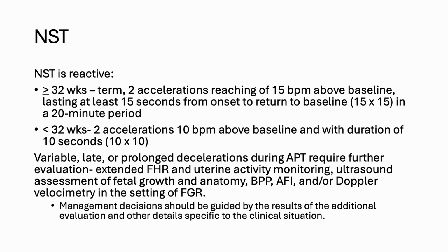So let's talk about decelerations. Sometimes during an NST, you see a variable, you might see a late. If there are contractions, you might see a prolonged deceleration during an NST. So this would require further evaluation. In most cases where I have worked with the Maternal Fetal Medicine office, we send the patient in for extended fetal heart rate monitoring.